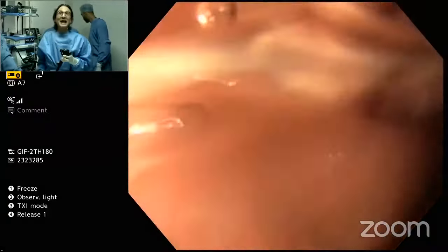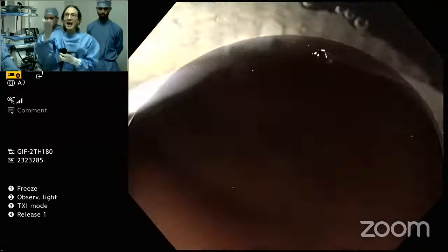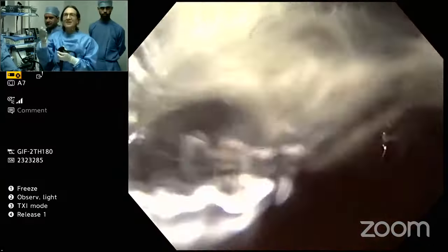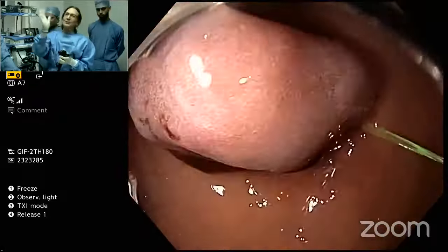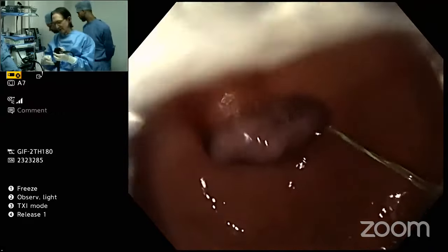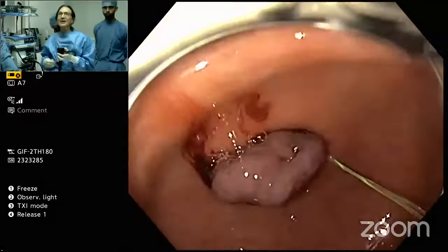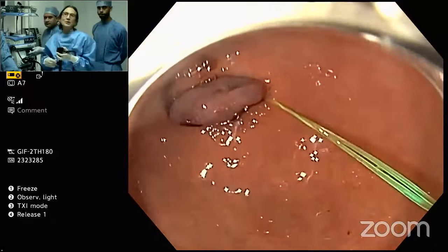Well, that's a great idea. You know what? I love it. See, this is innovation. Now you've done it and you can save on your snare. Use the same snare to cut through. Ah, beautiful. All right. Yeah, we're going to name this device after you. All right. So now this is a snare. And you're right. We already had the snare. You just hook it up to cautery and you could use it.